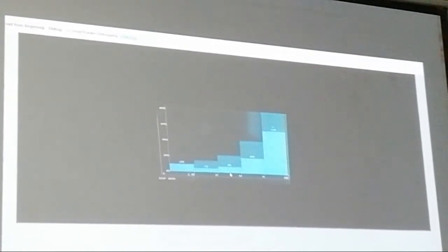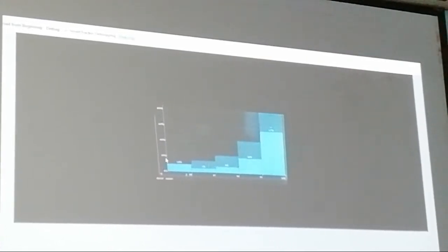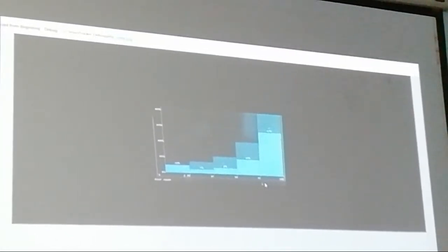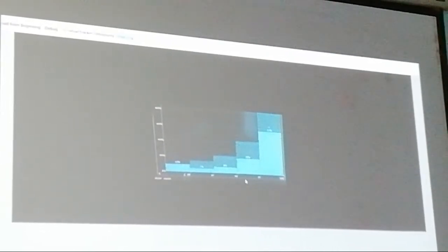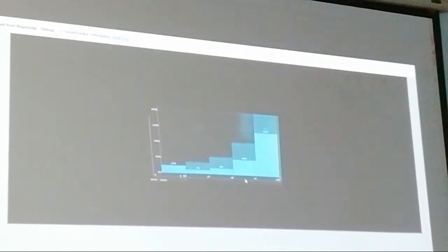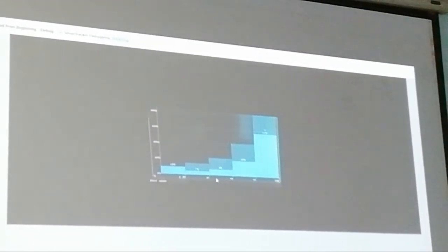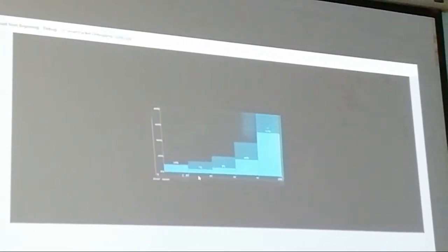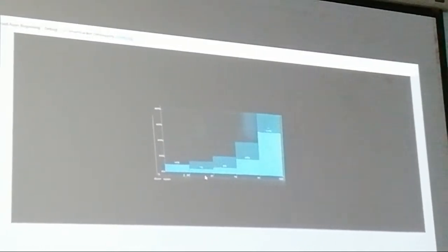Here on the graph, the y-axis is the percent of time, and the x-axis is the oxygen saturation as ranges. 95 to 100% represents hyperoxia, if the infant was on oxygen higher than room air. 90 to 95% is the target oxygen saturation in most of the units. 85 to 90% is within the target in some units. 80 to 85% is the range of oxygen desaturation. And at the last, less than 80% is the definition of hypoxemia.